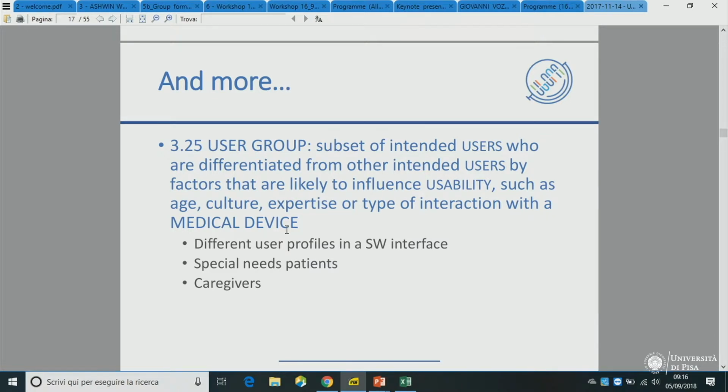Maybe the patient needs to tell you what happened during that monitoring period: I was walking upstairs, I was running, and that's why you see my heartbeat variation. And the doctor wants to comment in a completely different way because he wants to comment on the rhythm or whatever. So same information, different comments.